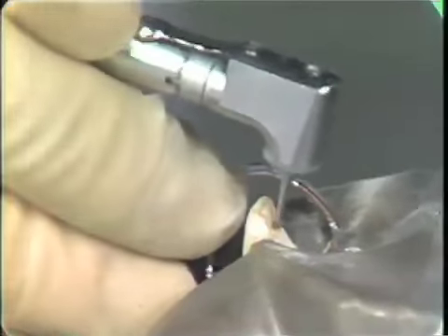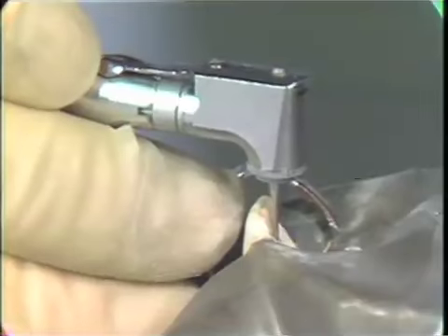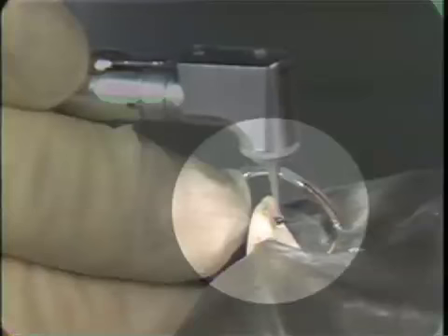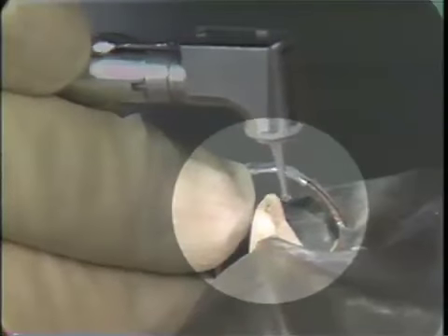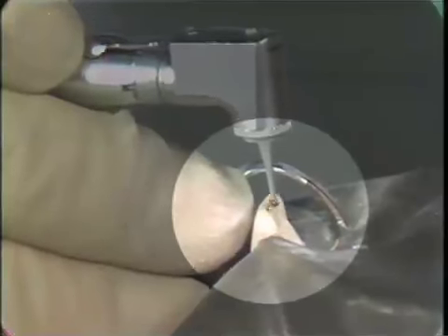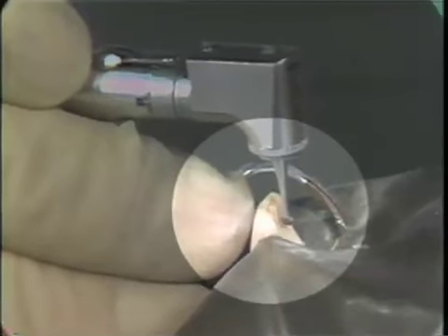You keep this slightly on the conservative side, since you can always go back and modify the outline form, based on the actual outline form of the pulp. As we said before, the next step is to get access to the pulp chamber. With the low-speed handpiece angled in the long axis of the tooth, visualize where the long axis of the tooth is. You start the handpiece and go directly to the pulp. You're not looking for the pulp. You should know where it is, and you go directly to it.